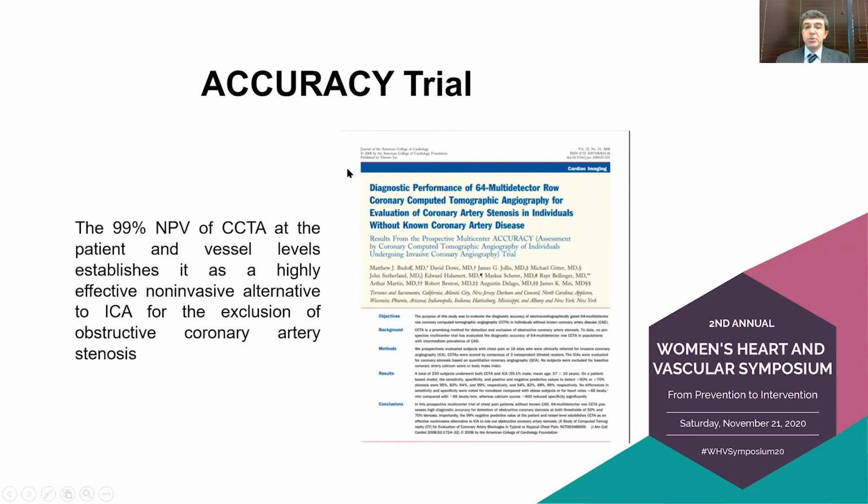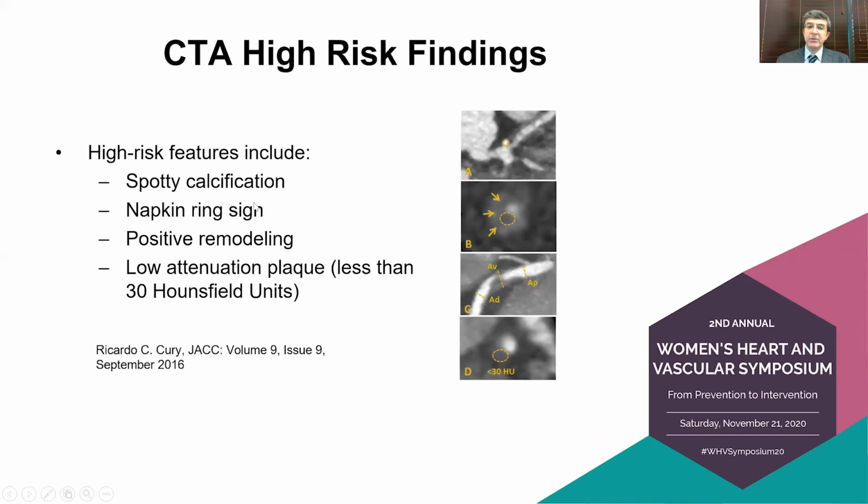Accuracy trial showed 99% negative predictive value for CTA. So CTA has a very, very good negative predictive value for evaluation of coronaries. Another thing that we can look at on CTA is the plaque morphology.